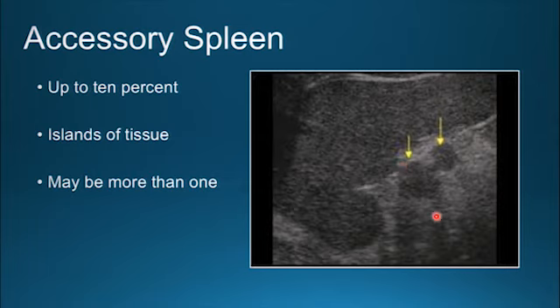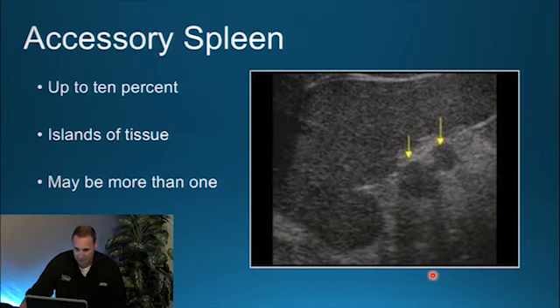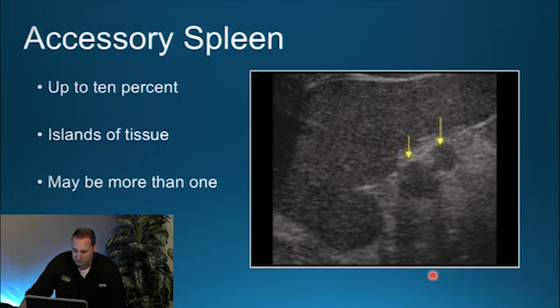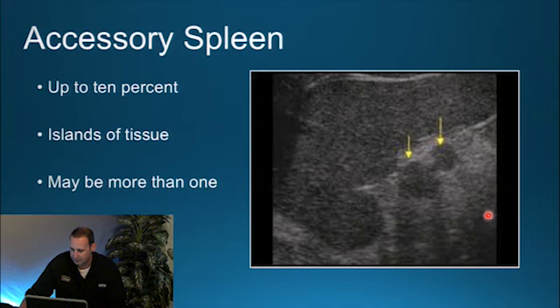Accessory spleen is not really an abnormality but more of a variant — up to about 10% of the population has an accessory spleen. They are generally located right near the hilum of the spleen and are islands of splenic tissue that mimic the spleen. Generally you find more than one, usually a cluster of two or three, as seen here by the hilum.